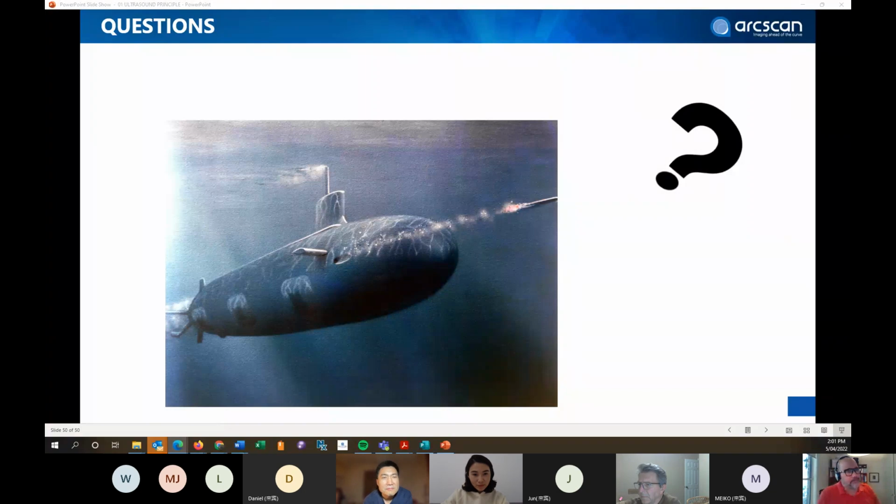But I haven't gotten into much detail on how they measure it, because they are measuring with a reference mirror. They compare the light going in against a reference mirror, so it's a little bit more complex than the ultrasound.